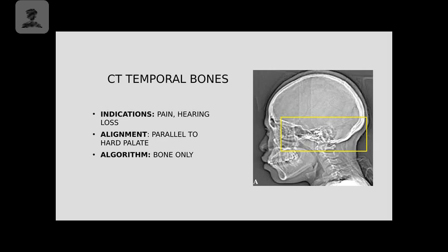very dense. That's the only way I can choose to describe them. They're very thick and dense. And so we don't have a whole lot of soft tissue that we're worried about. We're going to be looking more for the mastoid air cells that fall in the temporal bone and the petrous pyramids. We want to evaluate all of that.